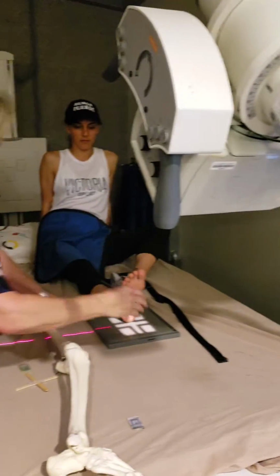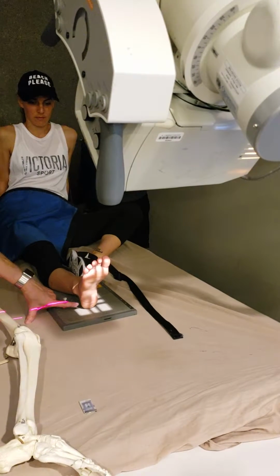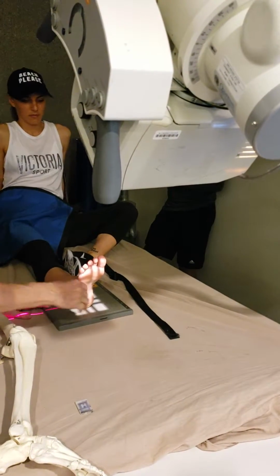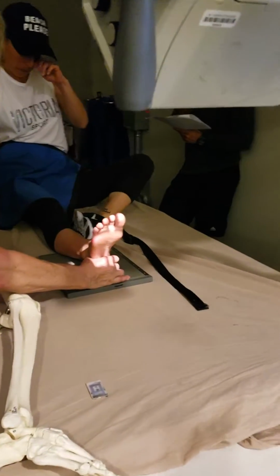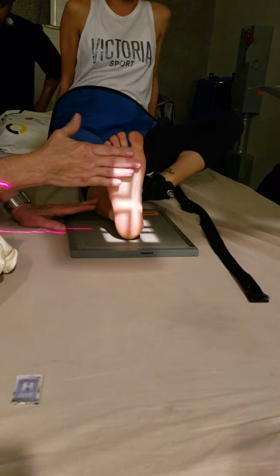Okay, can you scoot down just a little bit here? So remember I told you that you don't want to start with the heel in the middle of the cassette because this severe angle is going to project it up. So you actually want to bring it down a little closer to the edge. Okay, now what I'm going to do is have her flex her foot all the way back.